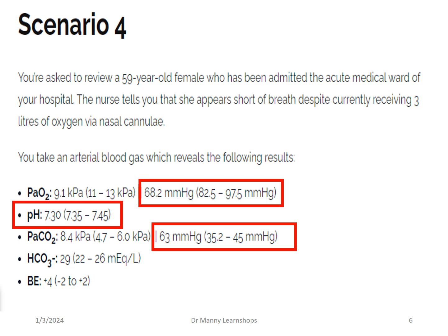So despite breathing being abnormal, they're hypoventilating. They're retaining CO2. When we look at the bicarbonate, it is high, indicating alkalemia. And the base excess is high, indicating alkalemia, or another term, alkalosis.